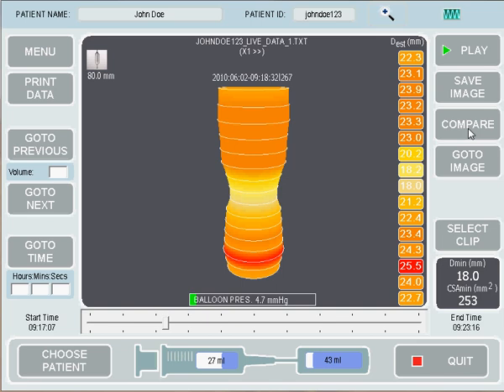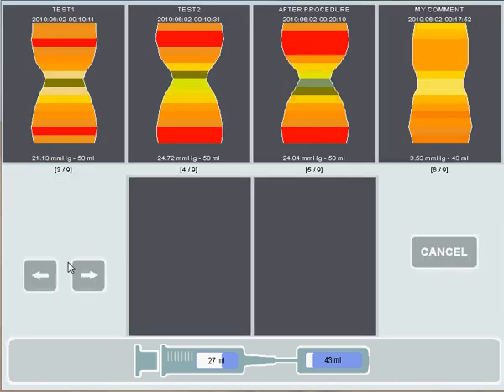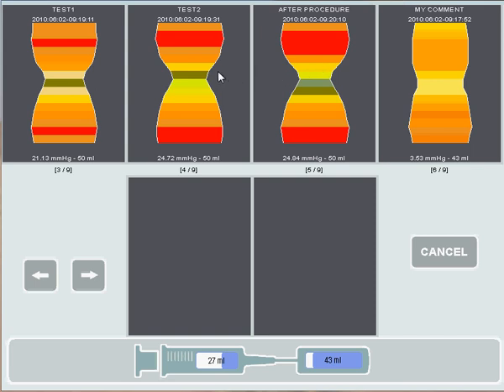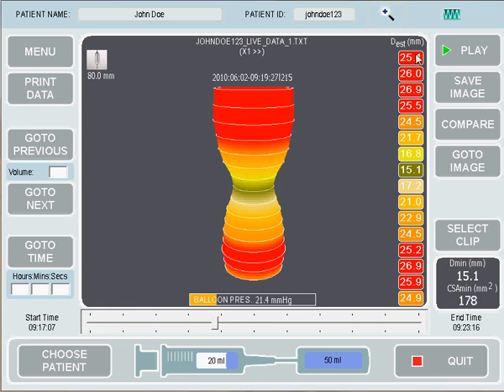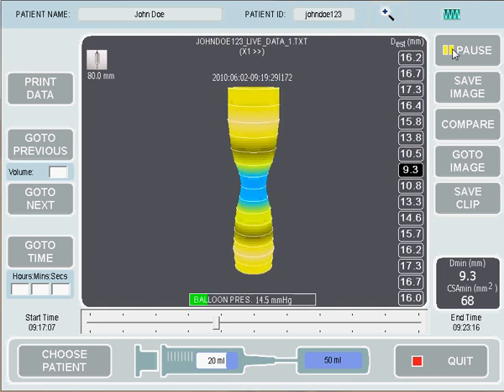If we knew that something interesting happened after we took a snapshot, we may like to watch the procedure from that point. If we press Go to Image and scroll to the snapshot we like — let's say test two — and press OK, it will go to that image. This is where the image was taken, and we can press Play and view from where this image was taken.